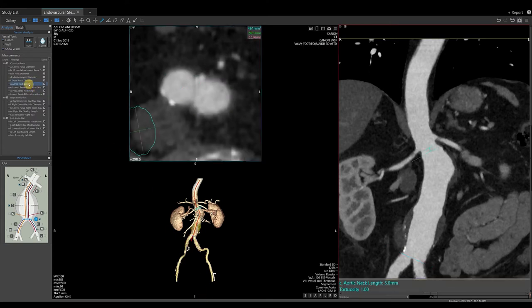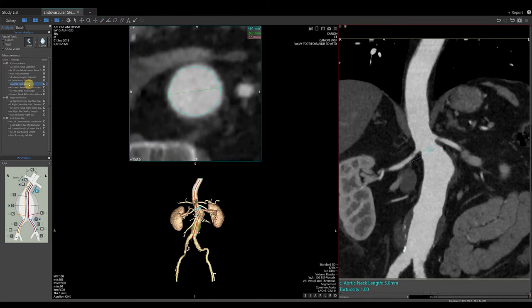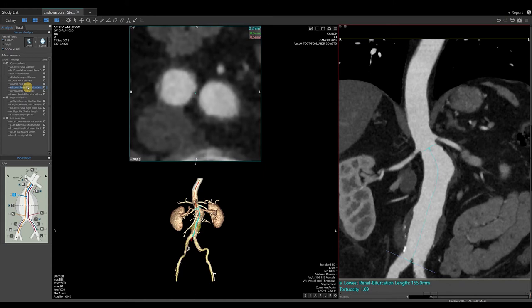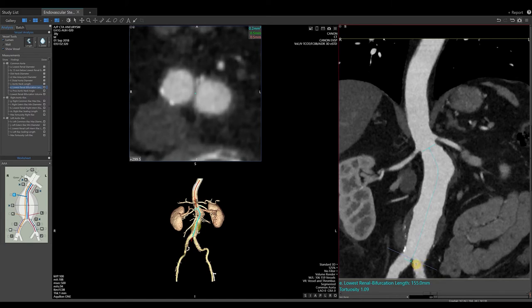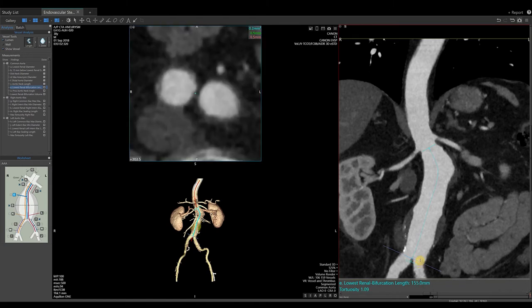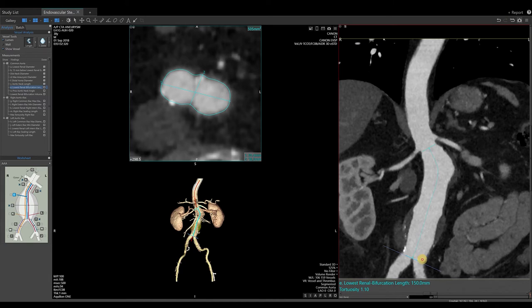Select the next measurement, aortic neck length. Again, the software automatically places this length measurement. It is based on the original location of the renal diameter and the distal neck diameter. If you agree, lock the measurement in place and take the snapshot. Select the next measurement, lowest renal bifurcation length. Again, the software will automatically place the measurement line for you. If you disagree, roll the mouse wheel to the desired location, then grab the light blue line to superimpose over the dark blue line. When happy, lock the measurement in place and take the snapshot.